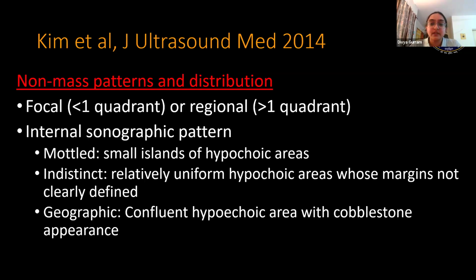And they even described the internal sonographic pattern: mottled, with a appearance of small islands of hypoechoic areas; indistinct, when the margins are not clearly defined; and geographic, when they're confluent with a cobblestone kind of appearance.